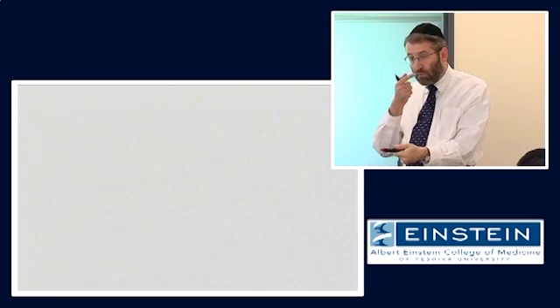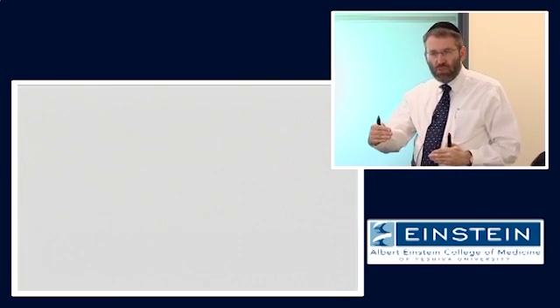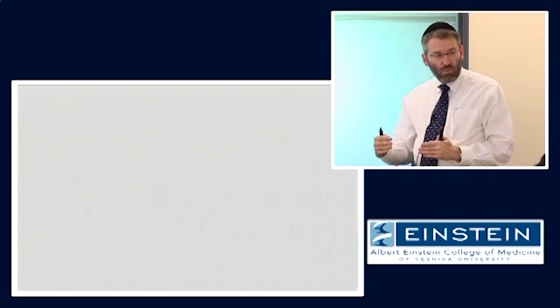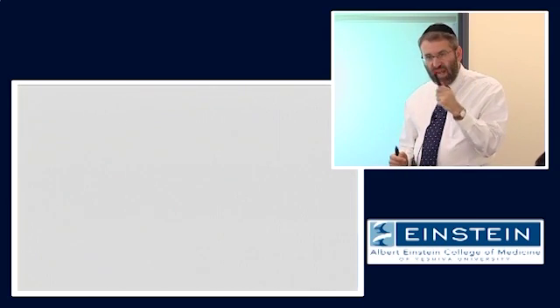So whereas we initially thought that rotating the magnetization to 90 degrees is always going to give us the most signal, right? That's still true if we're only doing it once. But as soon as we start repeating this multiple times, the rate at which you repeat it, and, by the way, the rate at which it recovers, will influence which angle of rotation will give us the greatest steady state signal.